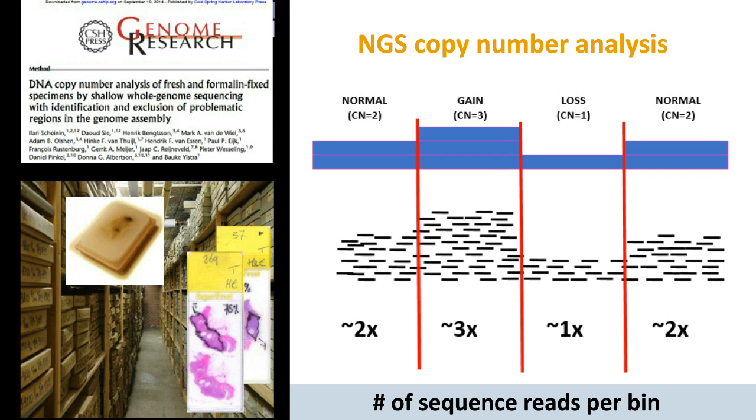And meanwhile, we've published this work in 2014, and we've processed thousands of samples. And technically, this always works very well. Of course, if the DNA is really not good enough anymore because of necrosis, you have a worse result. But in the end, this always works very, very well. I'm going to show you an example, because this is just a cartoon, of course. I'm going to show you an example of a DLBCL sample.